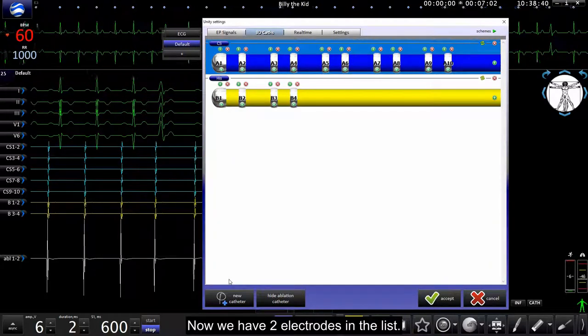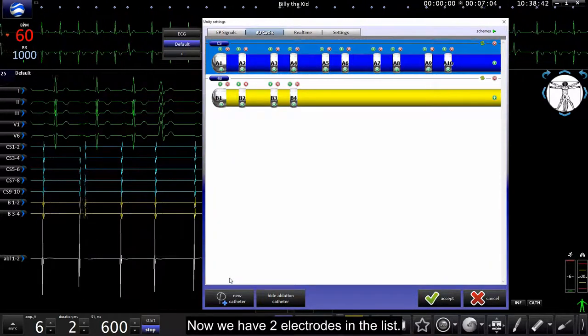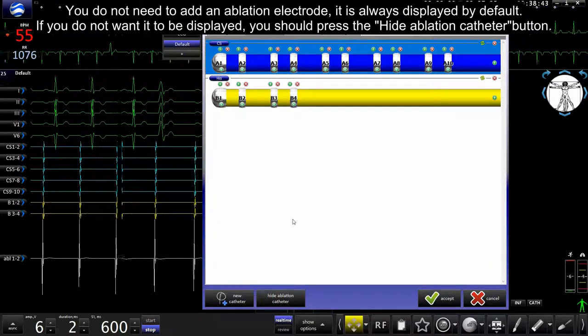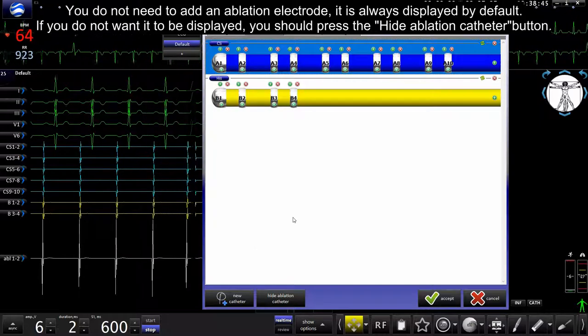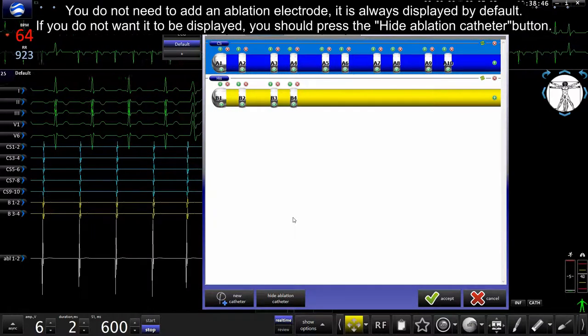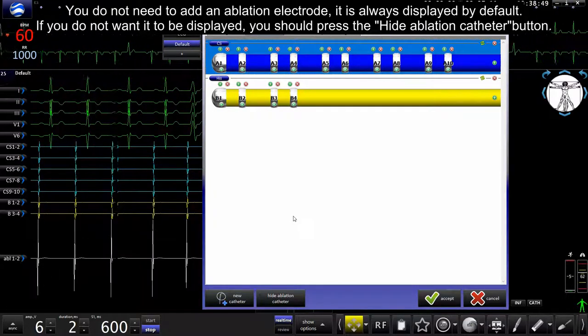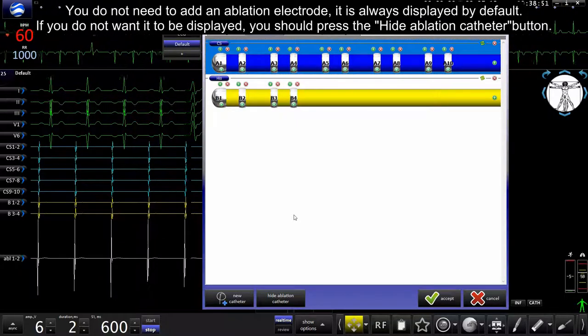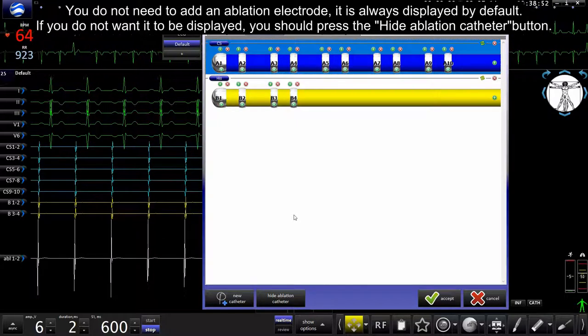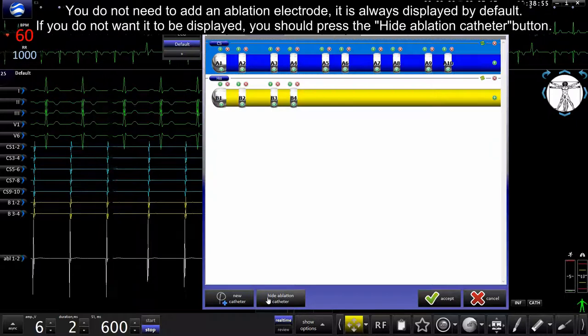Now we have two electrodes in the list. You do not need to add ablation electrode, it is always displayed by default. If you do not want it to be displayed, you should press hide ablation catheter button.